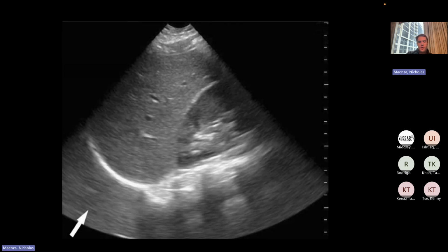Another thing to help you determine if this is mirror artifact or a true consolidation is that spine sign we discussed before. So this patient, even though they don't like the other patients we had with mirror artifact that had that very convenient hemangioma, not every patient has one. So if you do this ultrasound and you see what looks like a possible consolidation up here, but you're not seeing the spine, so there's nothing dense enough to help transmit sound waves, but you're concerned this is a pneumonia, this tells you that this is more just mirror artifact, because this thing you're seeing up here is a mirror image of that, but also this thing you're seeing here is not transmitting sound waves, thus you don't see the spine sign.